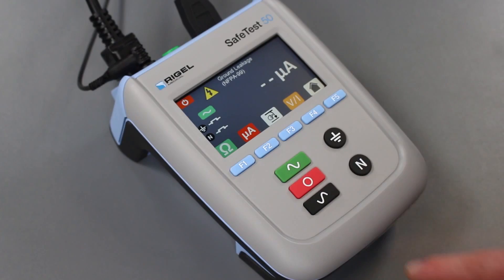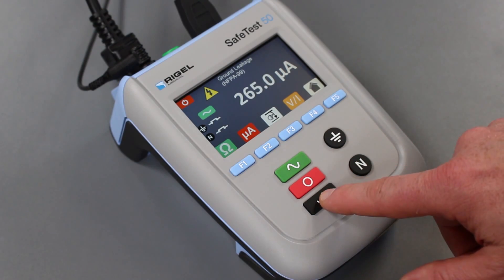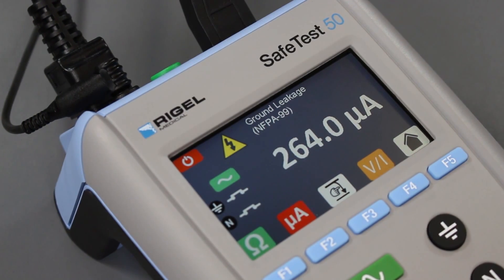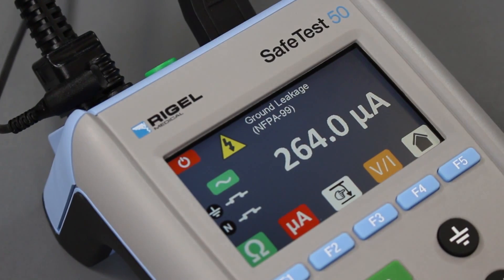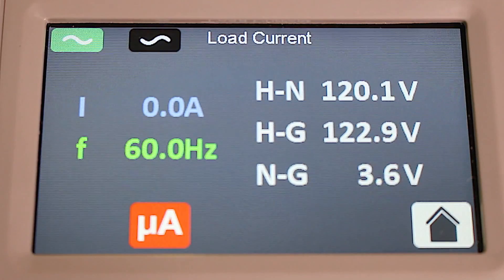To reduce test time, line voltage is applied manually, as well as the single fault conditions, open ground and open neutral. Line voltage, frequency, and load current of the equipment under test are clearly shown on the display by pressing the VI button, while the clear color screen displays accurate test results, which are easy to read.